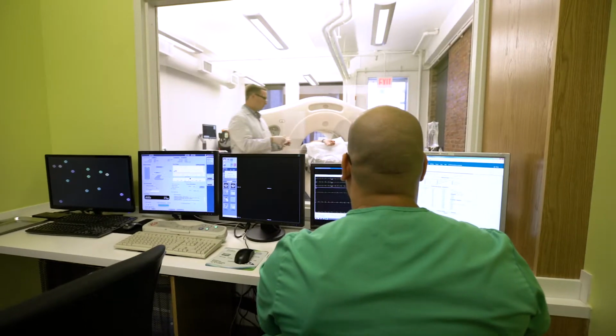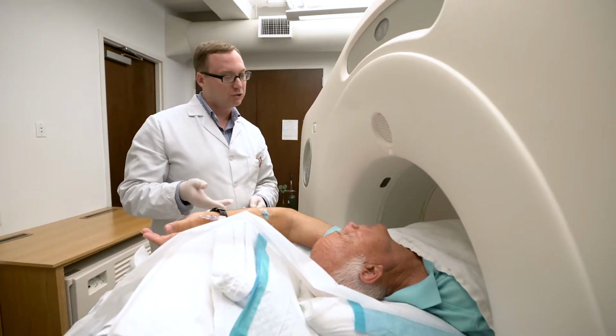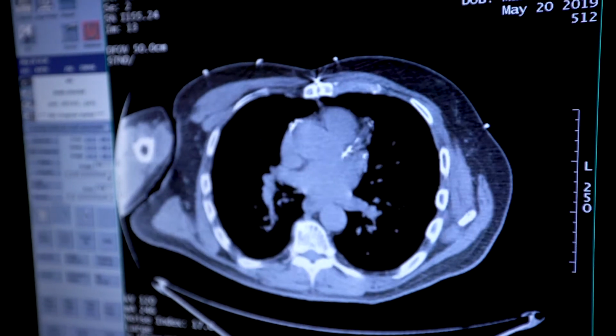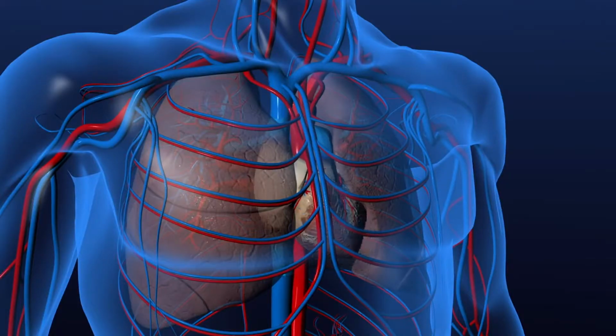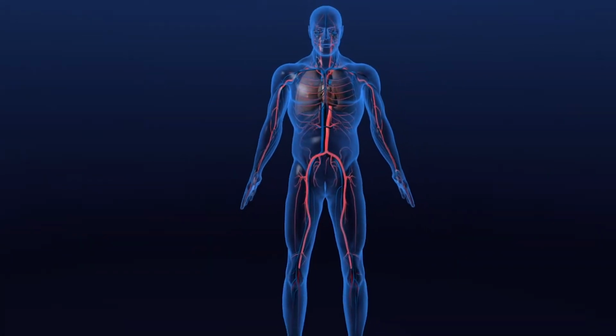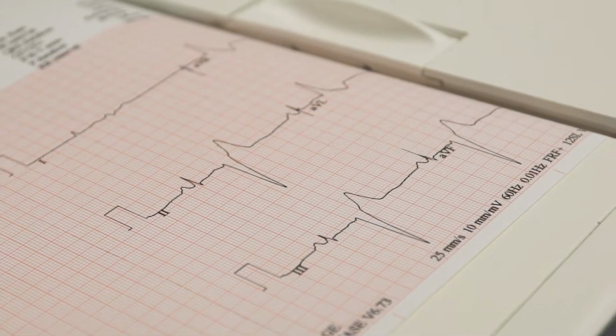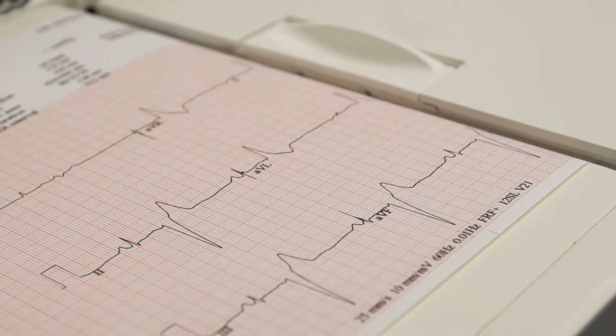Halfway through the scan, the technician will re-enter to administer a pharmacological cardiac stress to increase the blood flow to the heart. A medication is infused into an arm vein of the patient, which dilates the blood vessels of the heart maximally. This results in maximal blood flow to the heart muscle, and we can see whether that maximal blood flow is limited by any blockages in the coronary arteries. The severity of this limitation corresponds to the severity of blockages in the patient's coronary arteries.